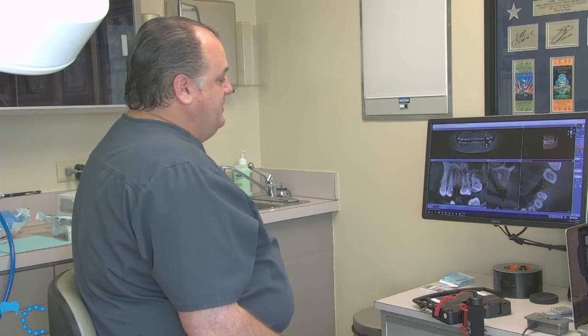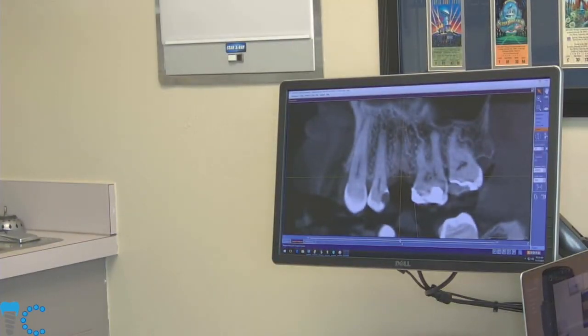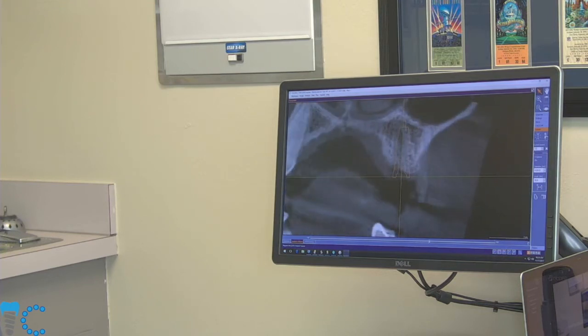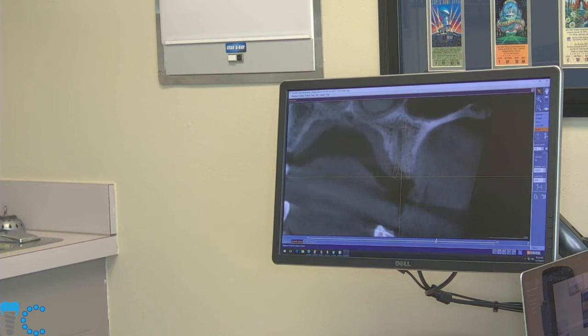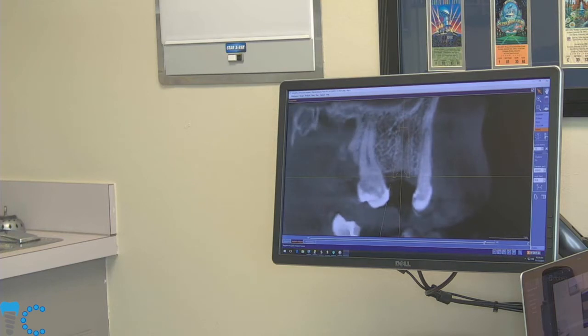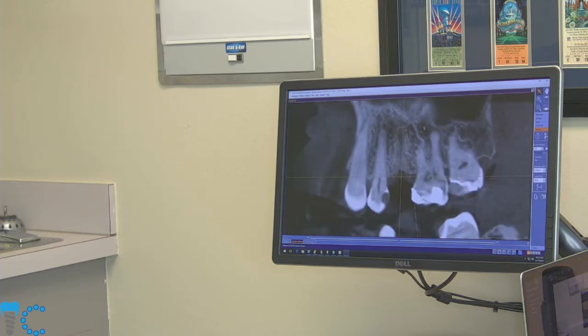So this is our patient workup. I'm going to enlarge this picture here. So now you can see very clearly our implant, and then what we like to do is rotate the patient around our implant just to make sure that we're adequate distance from adjacent teeth, that we're not into the sinus, that we're not perforating the buccal plate, that our implant angulation is acceptable, and that the size of implant we selected is acceptable. So again, we've rotated 180 degrees. We'll take it back to where it was, and this looks fine. And again, our little default 2 millimeter box helps us position our implant and make sure that this is what we want.